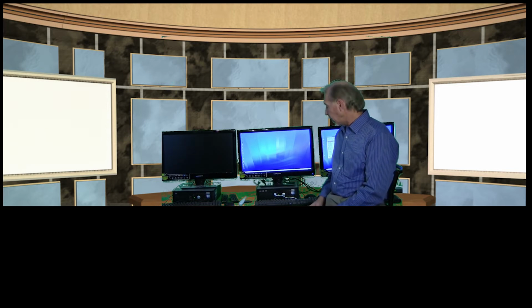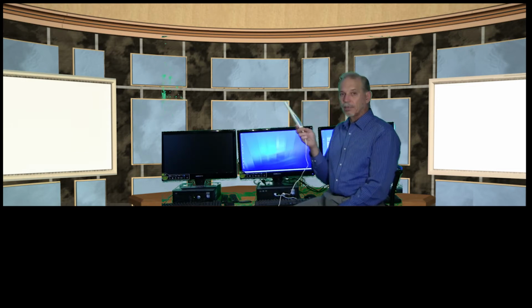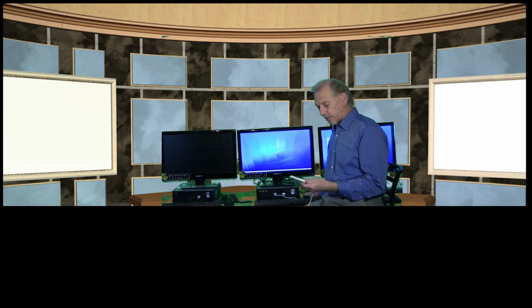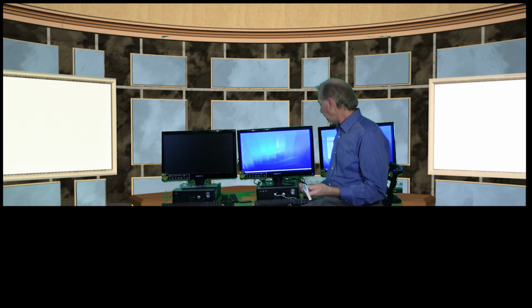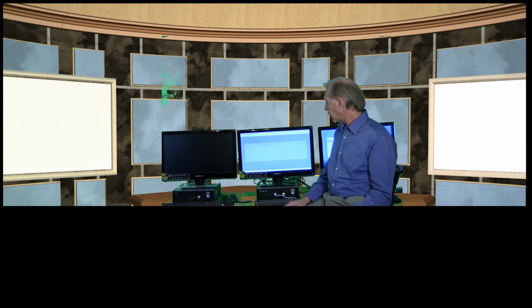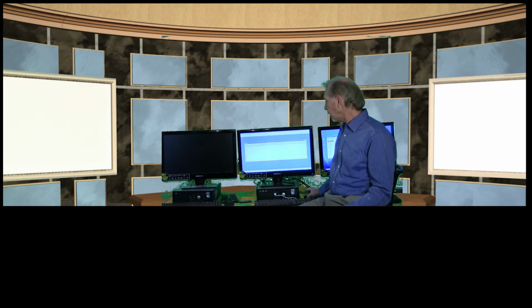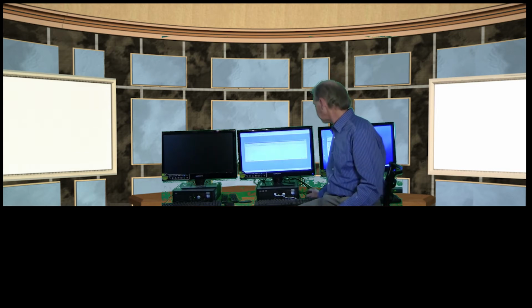First of all, we have the camera. This is our USB intraoral camera. Quite simple. Gives a good image, as I'll demonstrate in just a minute. And then we have the Dental Eye software. The Dental Eye software is one of the premier softwares throughout the world. It's the #1 software used in all the universities and hospitals in the U.S., and it's becoming more and more widely used in private dental practice.